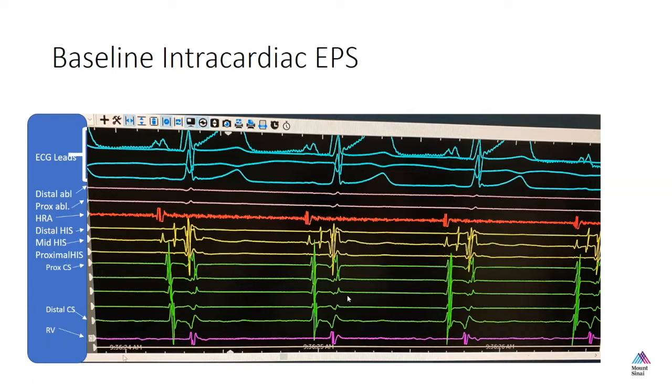So then we have the coronary sinus catheters. And this is where, a lot of times when you're looking at tracings from another lab, particularly if you're one day doing a board examination, take great notice of the direction in which the coronary sinus pairs are displayed. In our laboratory, we go from proximal to distal. Now, you notice that we're not being very consistent here, right? We're doing distal to proximal His, but we're going proximal to distal coronary sinus.